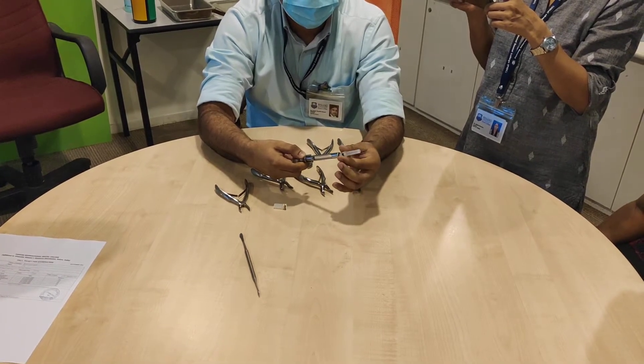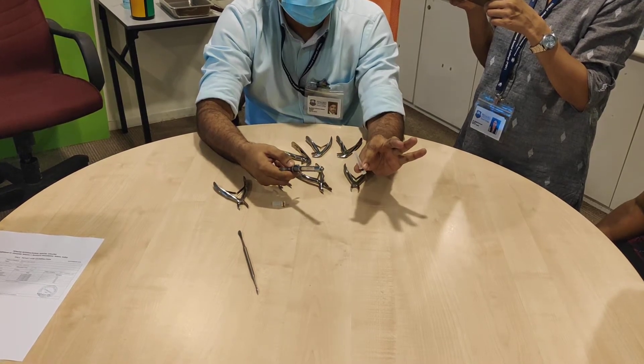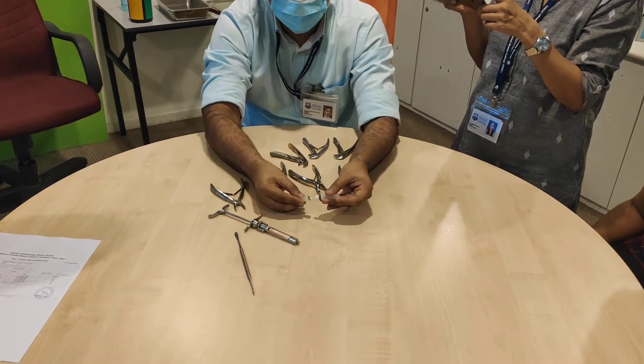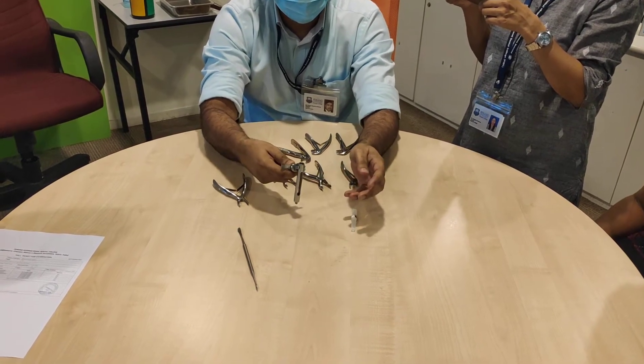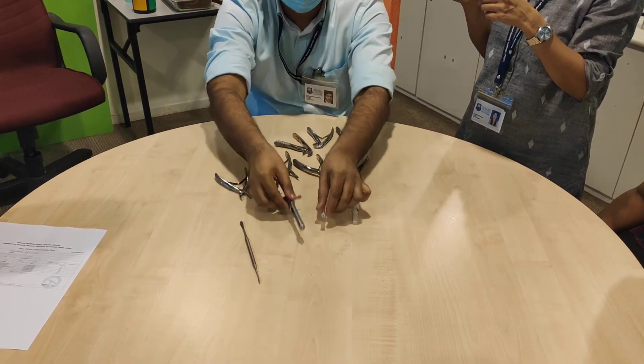Okay, same thing for unloading. Twist. Pull — this goes into the sharp bin. For now we don't have a sharp bin so I am just going to put it back. Then pull this out and we are done.